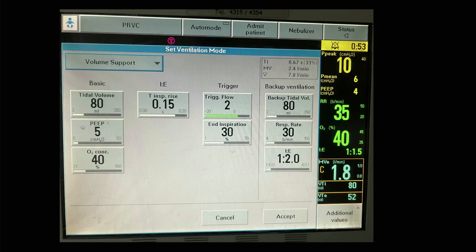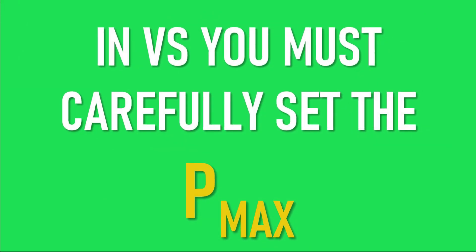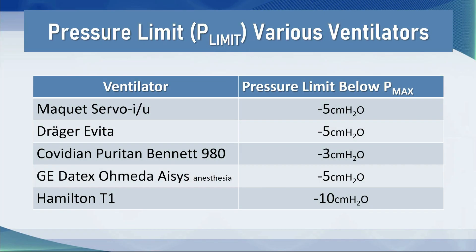This is the setup on a Servo ventilator — this is PRVC originally. You can see we're changing over to volume support ventilation and here the tidal volume has been set. It's important to understand that on this particular pop-up window there is no place to set the Pmax — you've got to go and look for this somewhere else in the vent settings and you must set it. It is imperative in volume support, just like in volume guaranteed pressure control, that you carefully set the Pmax.